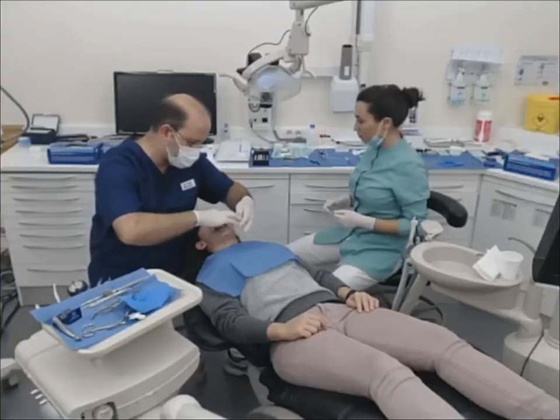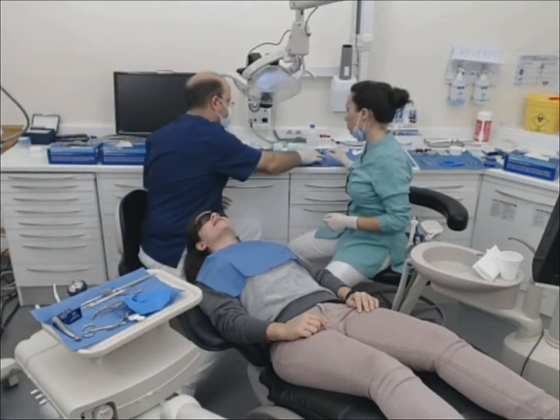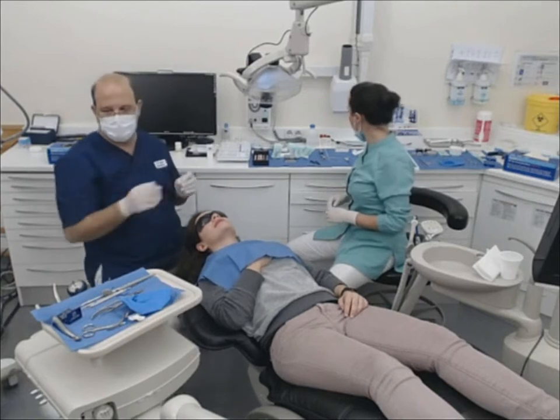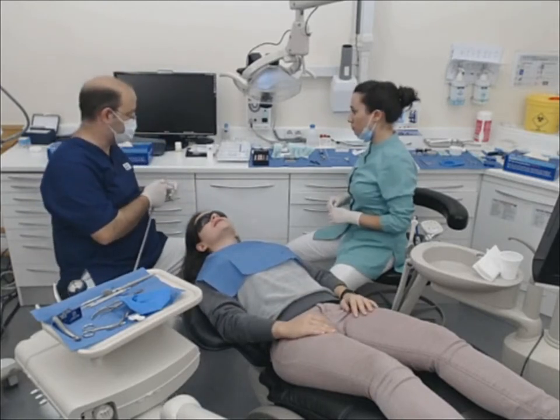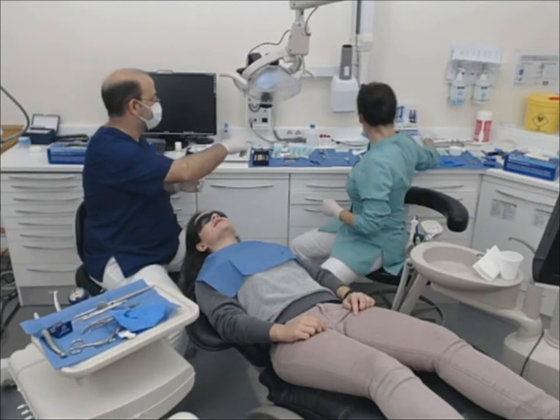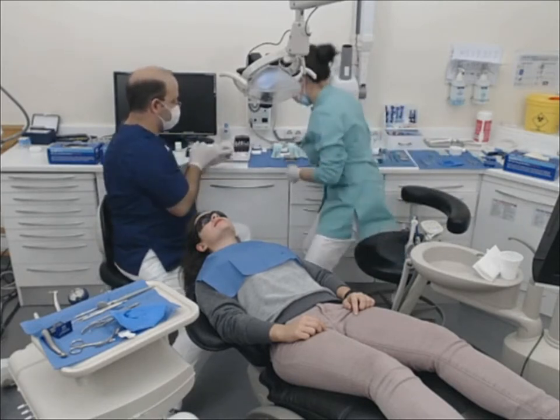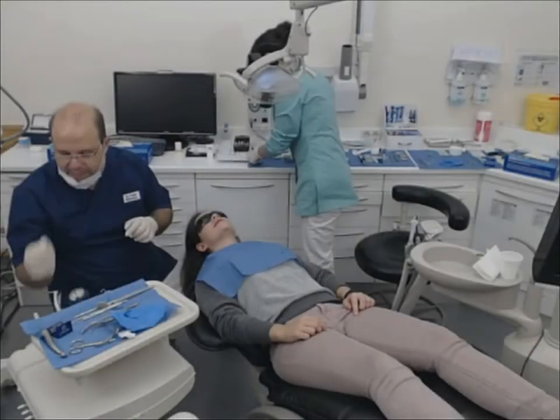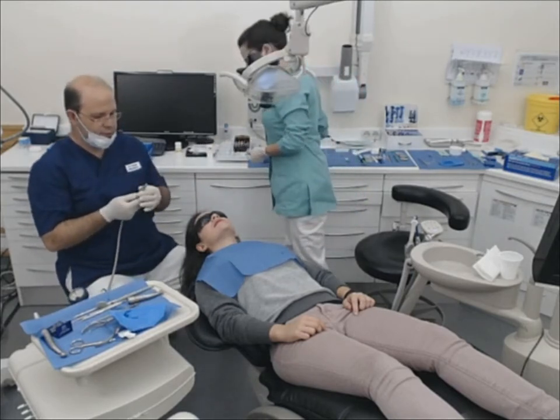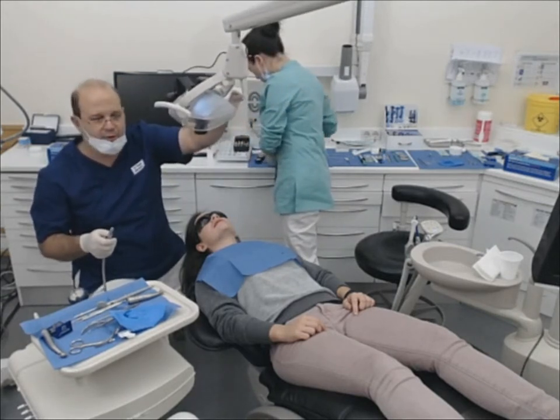So of course I'm gonna try to put the rubber dam again. The first step is to cut the sprue. I'm just gonna put the light a little bit for this side of the camera, so you can see.